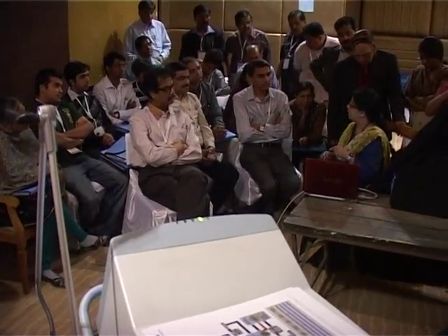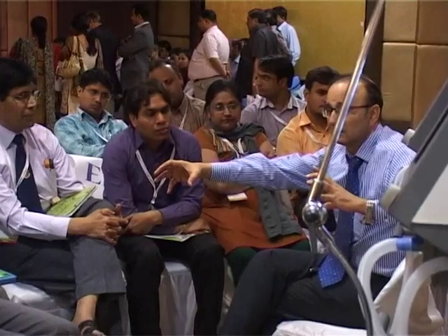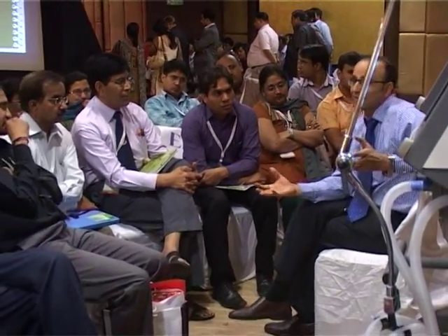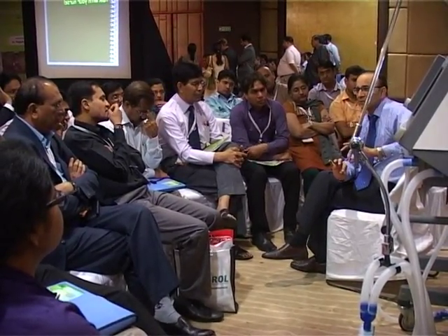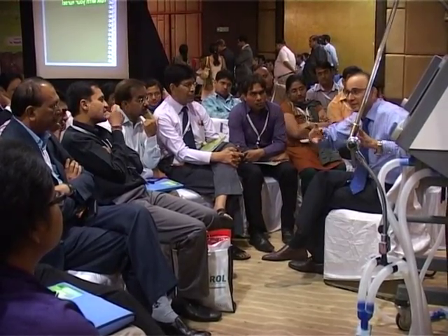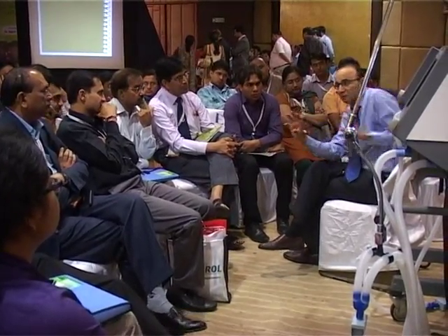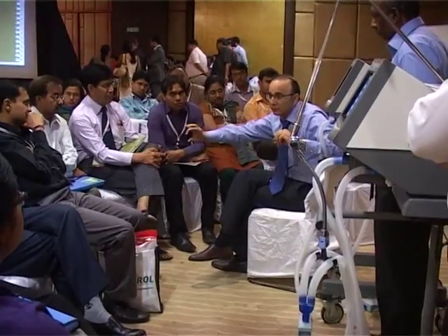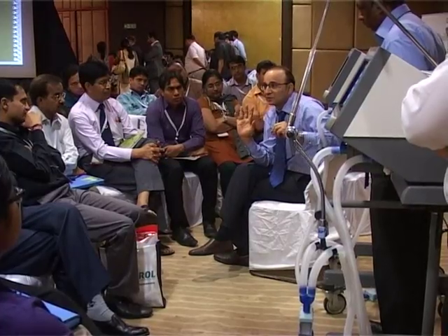Brain is already injured. And if there is hypoxia on top of it, if there is hypercapnia on top of it, the brain injury worsens. The volume the patient gets will now depend on the resistance of the airway and the compliance of the lung and chest. So this is the only difference. Both can be time triggered and patient triggered. One is getting a flow, actually air is coming, this is the number you have given. So when I say flow, pressure will differ, whatever pressure. If there is a leakage, pressure will be more. But the machine will ensure the patient gets that flow. And when your cycling mechanism is reached, inspiration will end and expiration begins.